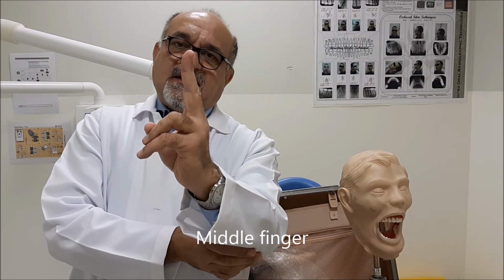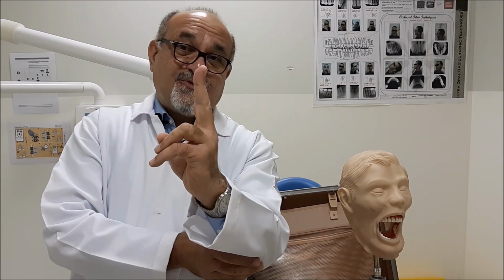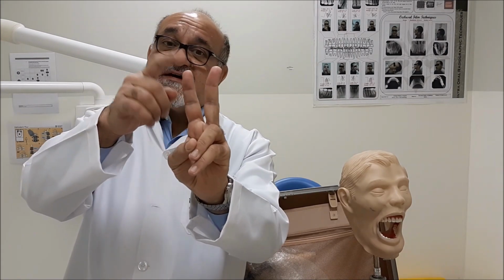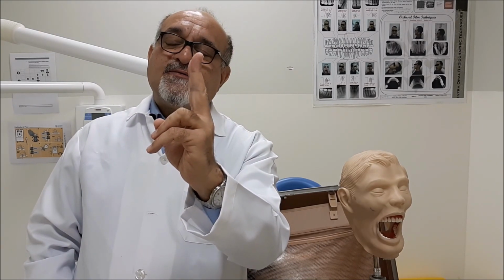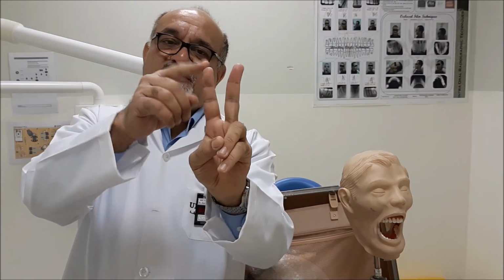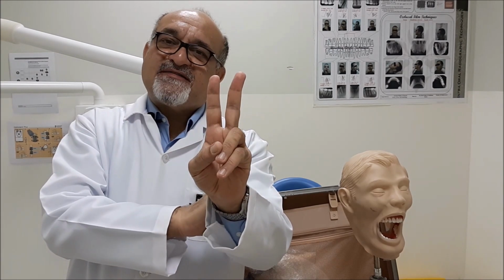Your middle finger, in this case the palatal canal, is far away from you, right? And your index finger, which is closer to you, is covering the middle finger. So this one we will consider as the buccal canal, and this one as the palatal canal.